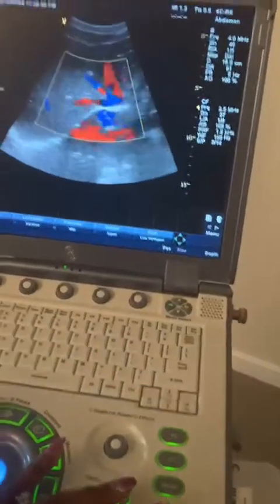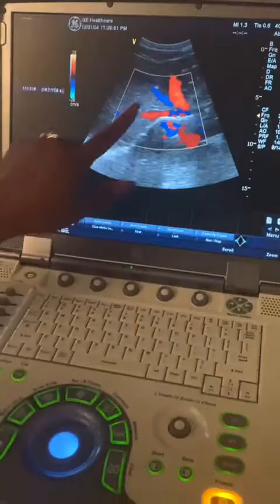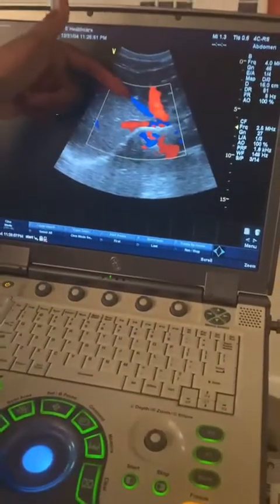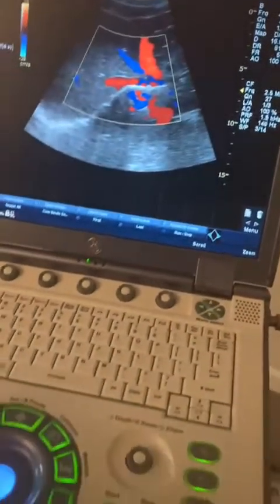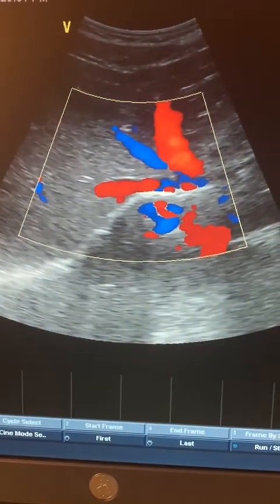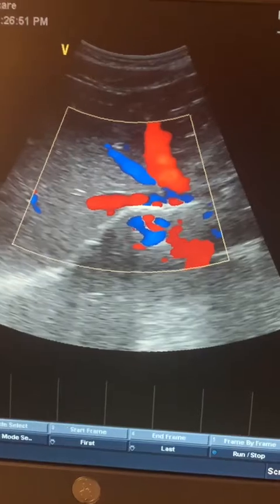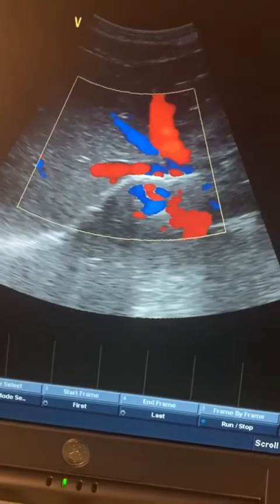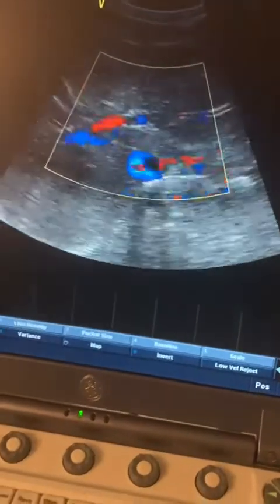Take in that deep breath again. You can see the middle hepatic vein. Another thing you want to do is put your angle right on it. Some people don't like to use the 60-degree angle, but I like to use the 60-degree angle when looking at my vessels. The reason I like to do that is I love being parallel to the vessel at all times. You don't have to do that, but make sure you follow your department's protocol while doing this imaging.